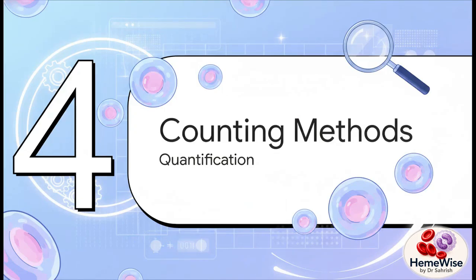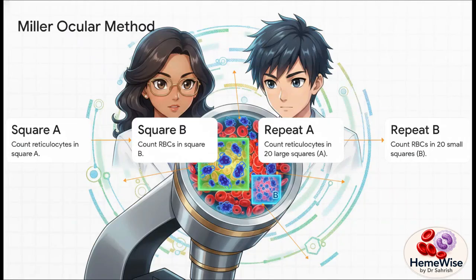This brings us to Section 4, Counting Methods and Formulas, covering both manual and automated quantification. Let's dive into the actual math of hematology. For manual counting, the Miller ocular disc method is just a beautifully elegant optical procedure. You insert this disc right into the microscope eyepiece, and it gives you two squares. You count your stained reticulocytes in the large square A, and you count your mature red blood cells in the smaller square B, nestled down in the corner.